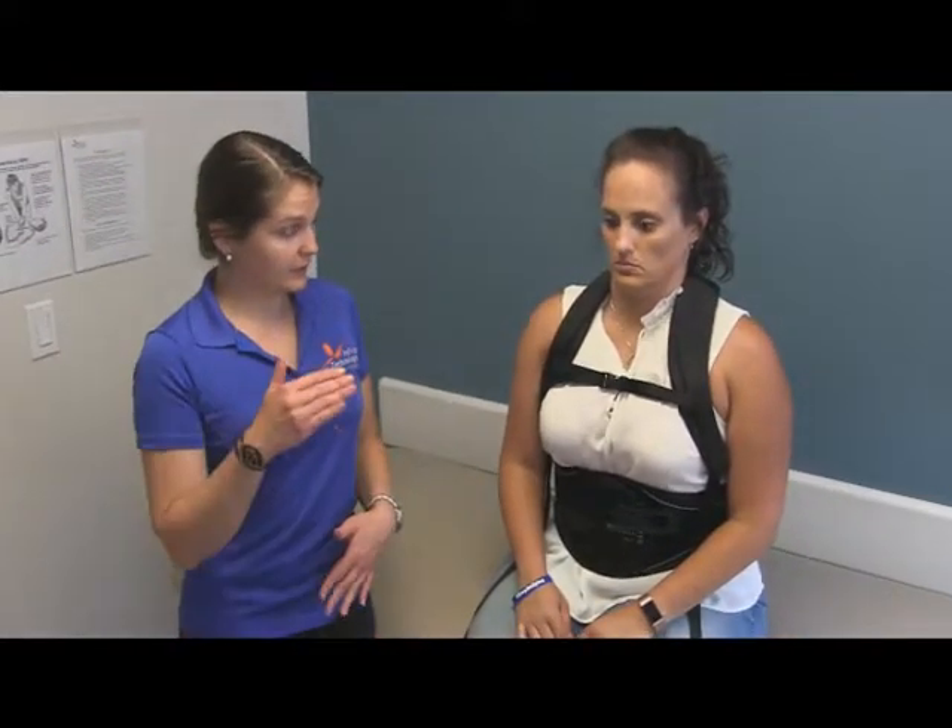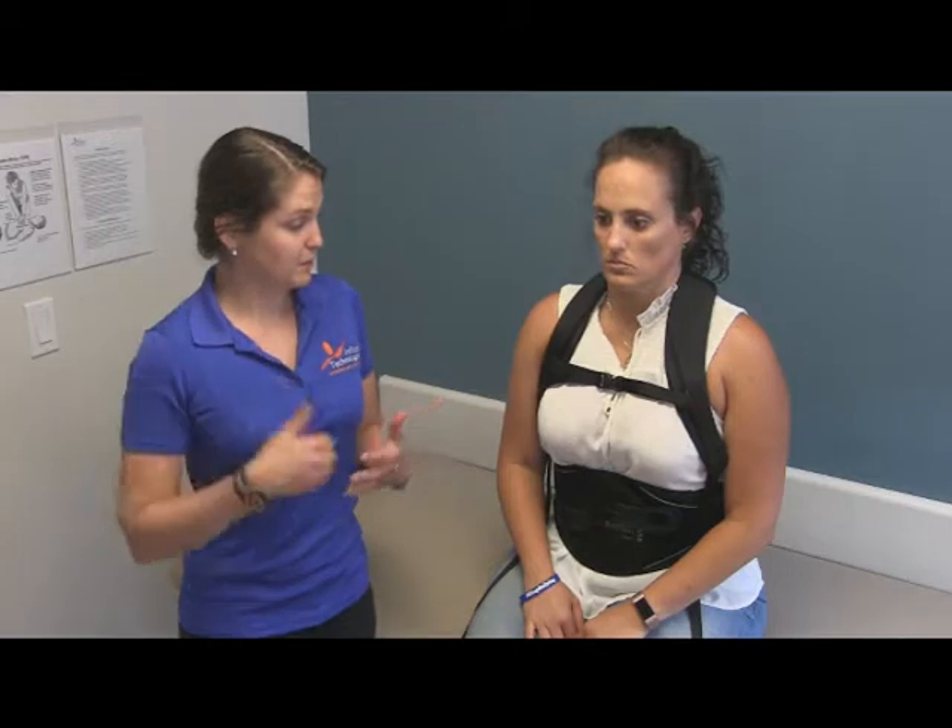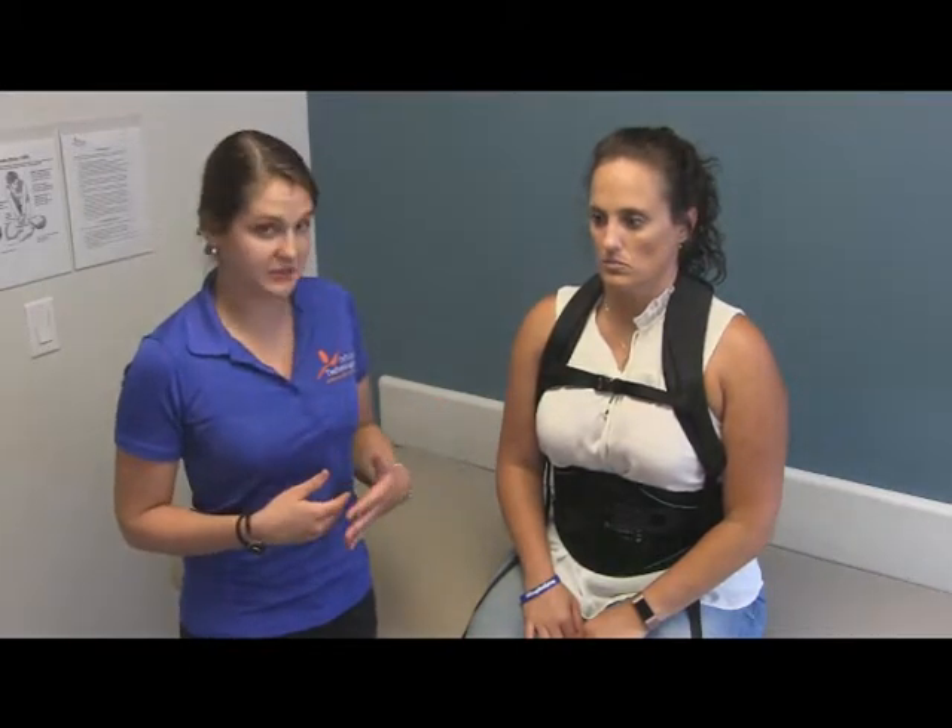This brace is meant to keep your spine in alignment. It controls the lumbar, which is the lower portion of the back, and the thoracic spine, which is the mid portion of your back by your shoulder blades. And that's how you put on an Aspen TLSO sitting up.